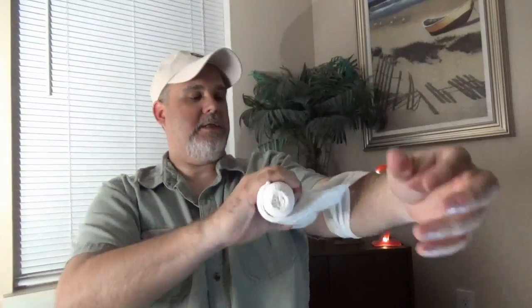The other thing I really like about this product is this loop right here. If you're an outdoor person, law enforcement, fire, EMS, or any type of first responder, this is something good to have in your kit. The reason this loop is here is that it allows the bandage to be applied one-handed. That's important — if you get hurt and you're the only one there to render aid, you need something like this.